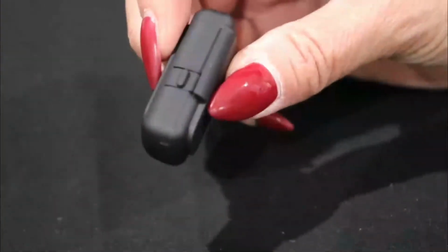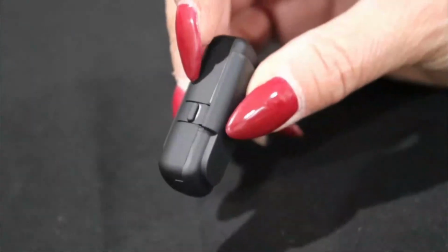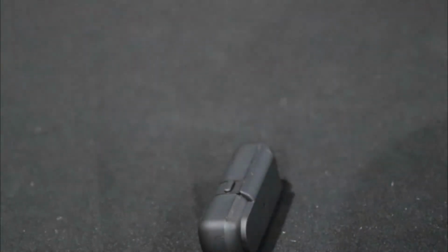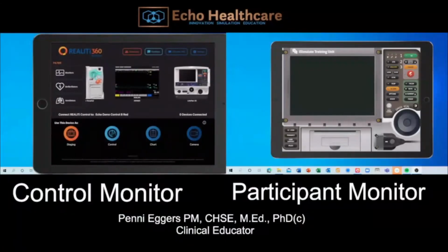And you can see that the module now does not have the blue light. Doesn't mean that it turned off. It just means that it's now ready to go. I want to go to my facilitator pad and open my Reality app. It's going to bring me to this screen. I'm going to tap on the blue button Control.